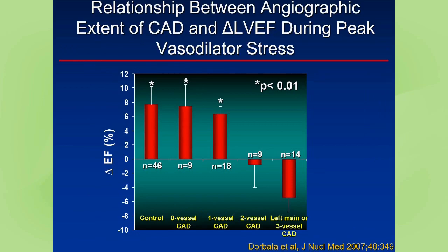In addition to the other components that I talked about that were specific to cardiac PET, such as our ability to look at absolute flow and coronary calcification, there is additional value in the fact that we typically get both a resting and a true stress left ventricular ejection fraction. So the patient is under the camera and getting imaged as the vasodilator is going in, and such. We would consider that a peak stress ejection fraction.